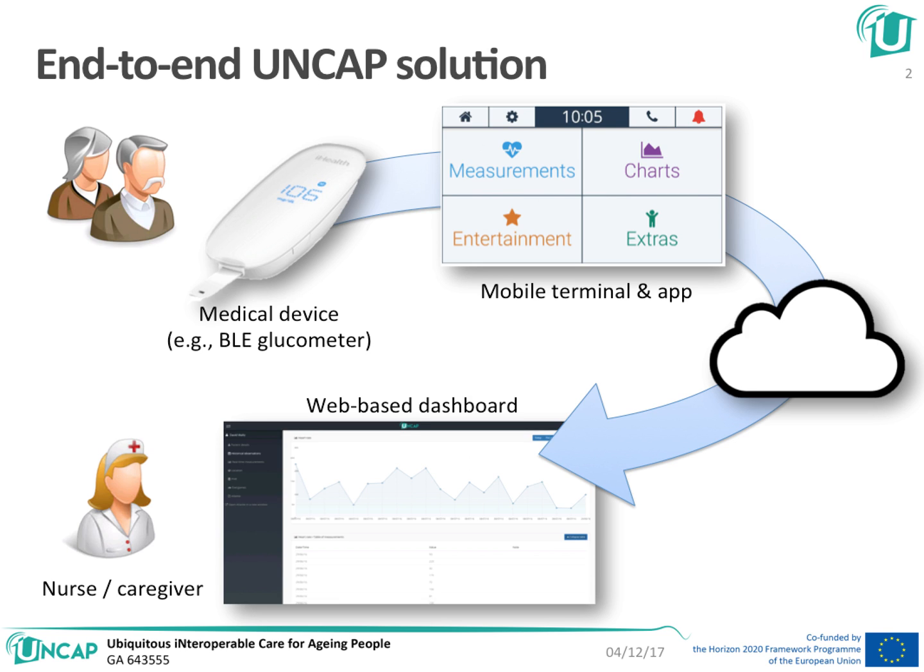The Android app UNCAP Box runs on basically any Android hardware, smartphones, tablets, or even set-top boxes, and the data is pushed from the Android app to the backend, from where it is loaded into the web-based dashboard and can be inspected by a professional.